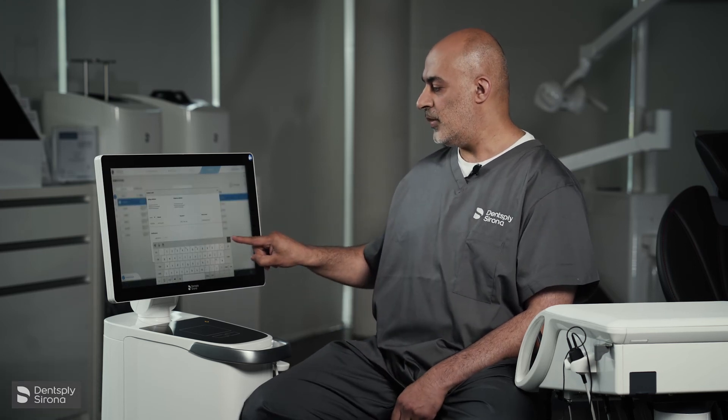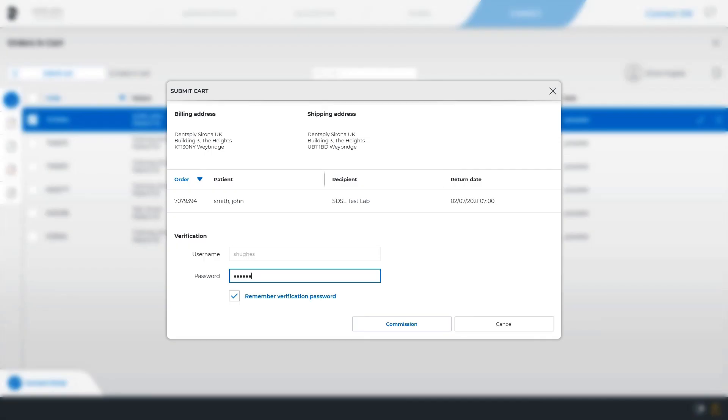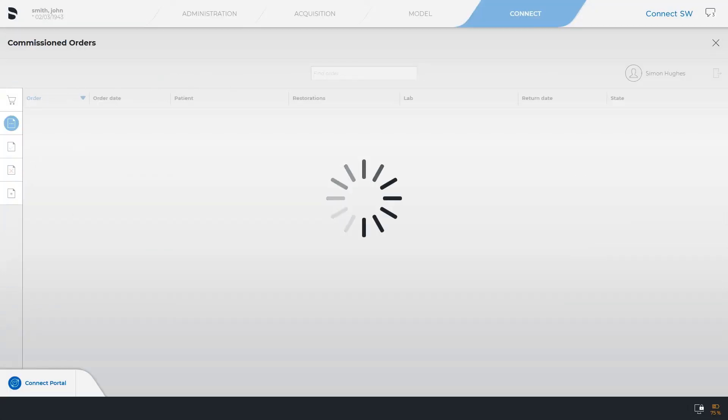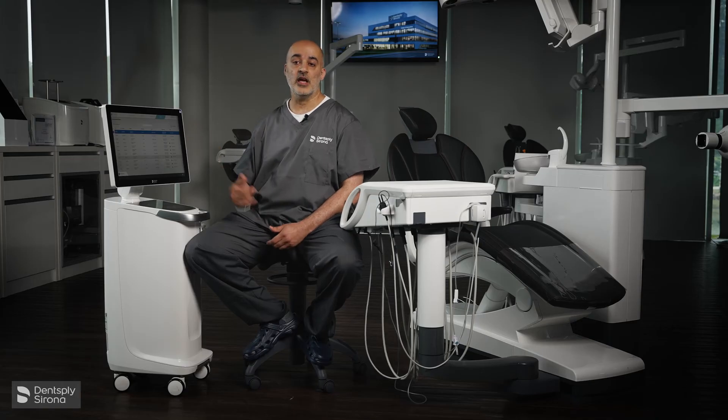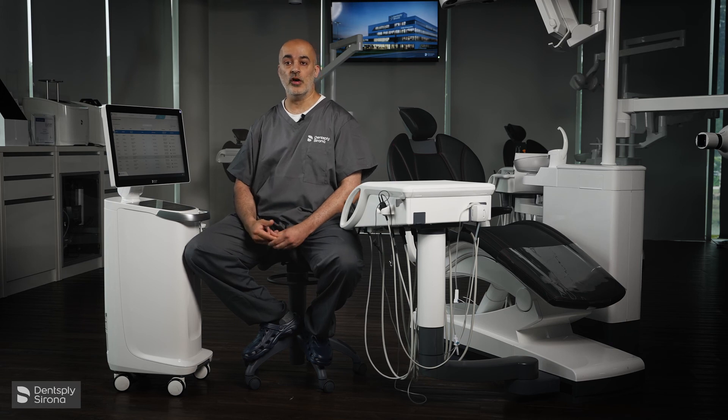We'll now submit to cart. When you submit, it will ask you for verification again — you will then select Commission. That is your Connect Case Center workflow.